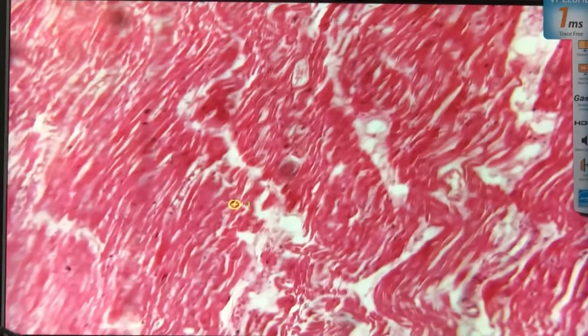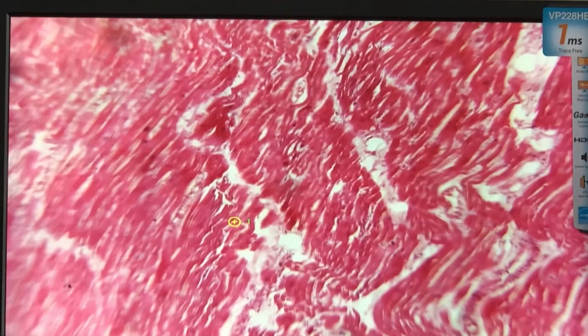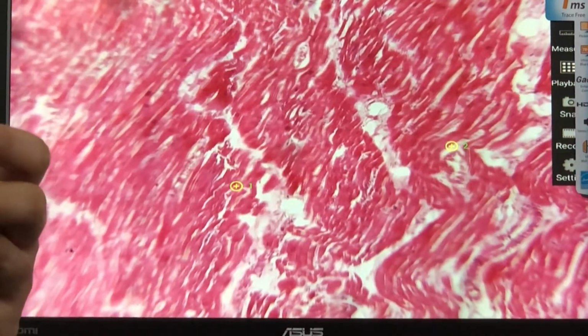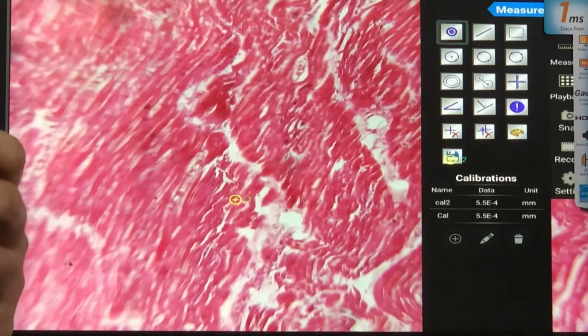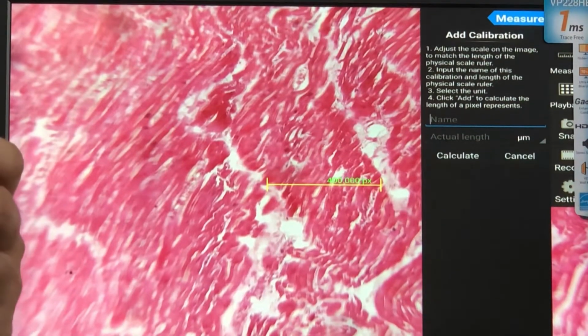Cardiac na ito dito. Ano ka to? Diri? Diri. Ma'am? Itad kasi yan. Anak man siya. Spindle siya. Estimate tayo.